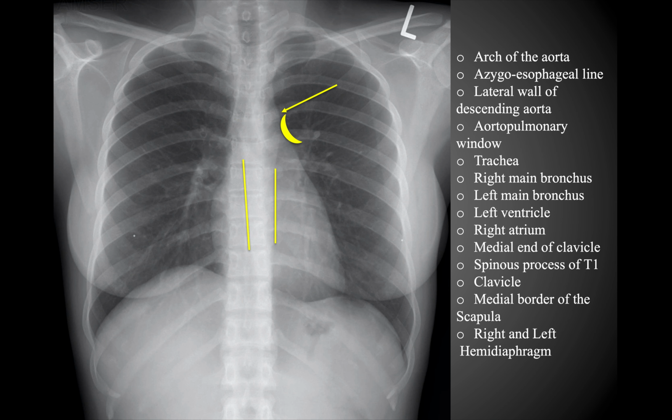Then you can see the trachea. Notice how you can see this darker outline here, and then you can see that continuing down into the main stem bronchus down here. Just keep in mind that because air is radiolucent, you're going to have a more black appearance, just like you can see the air over here appears black on the image. Same thing here where the trachea is. You're going to see sort of a shadow effect from that. And that's the same reason the lungs have a dark appearance, because they're primarily filled with air.